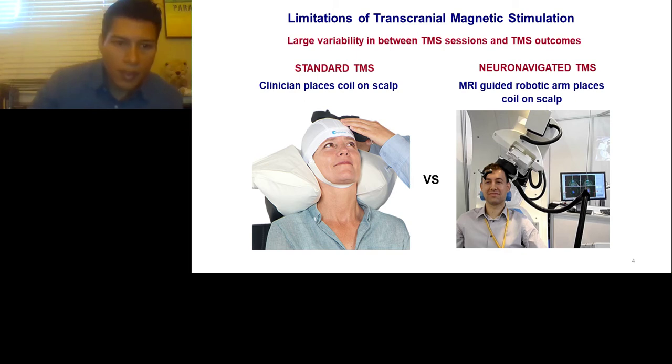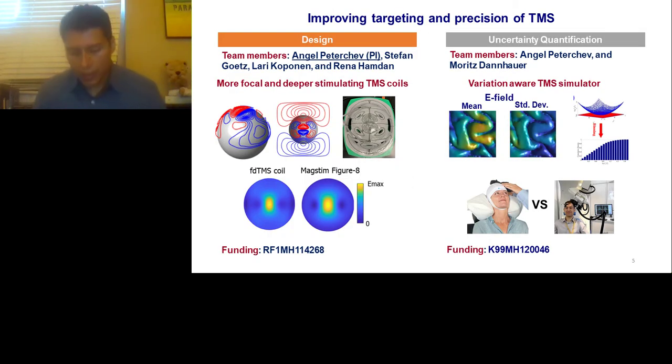And so now that you know what TMS is all about, I'm going to tell you about my contributions and specifically how my work deals to address these limitations. And so in a nutshell, I developed a procedure for synthesizing new TMS coils that permit the generation of electric fields that achieve fundamental trade-offs between focality, depth, and energy. And then I use this to design coils which are twice more focal than existing ones. This is the first improvement in focality of TMS coils in decades.